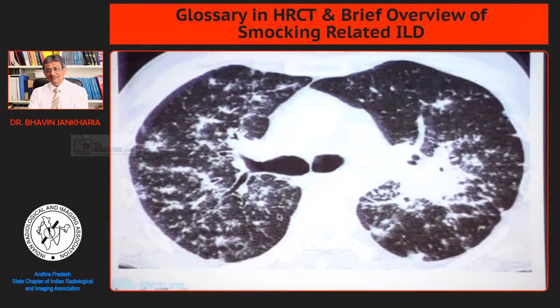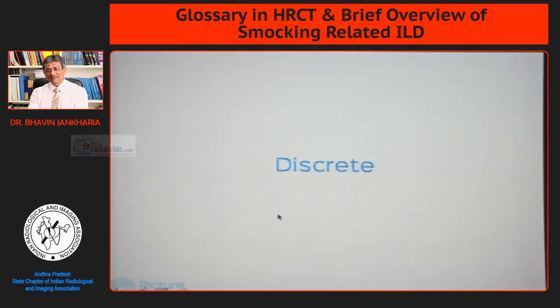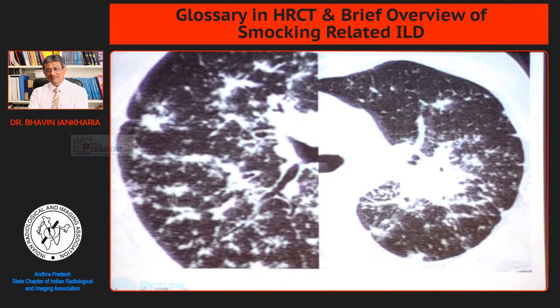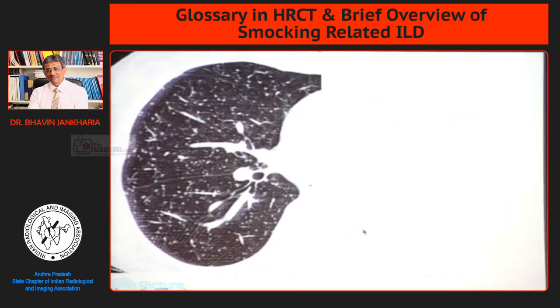You can also get discrete, well-defined nodules. These are well-defined where you see really nice well-defined nodules. These nodules have a perivascular course, a fissural course — some are along the fissure — and some are subpleural. This combination of fissural, subpleural, and peribroncho-vascular distribution of discrete nodules means we are dealing with sarcoidosis.